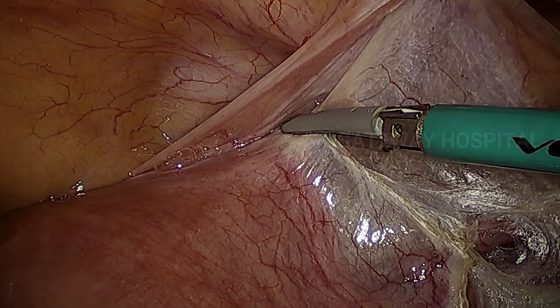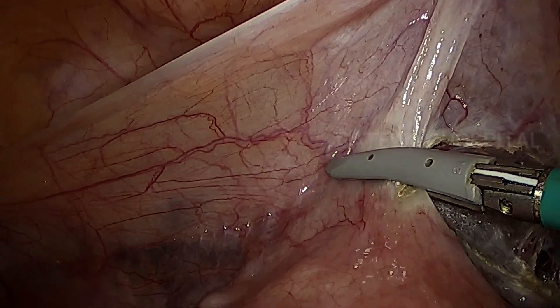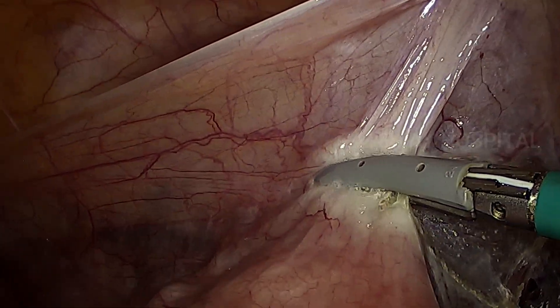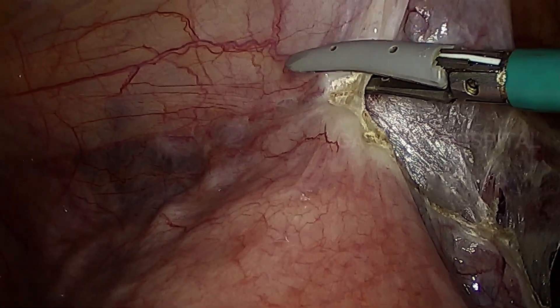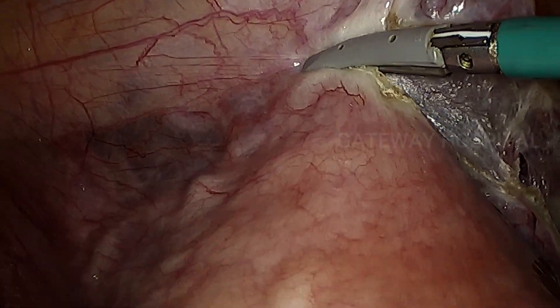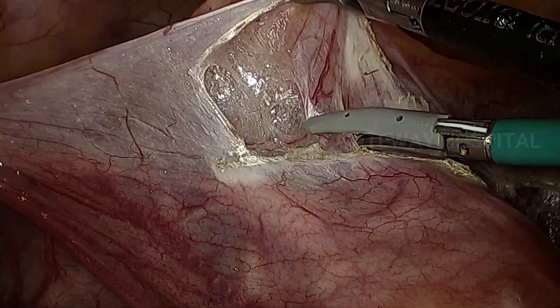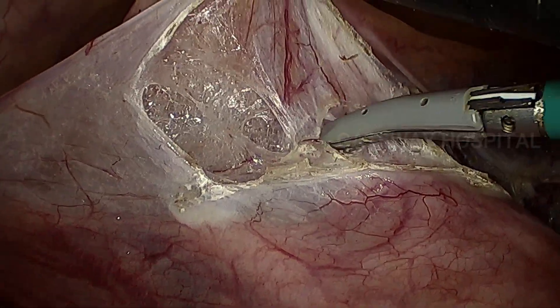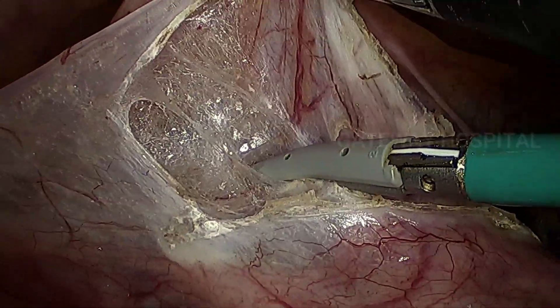In case of a previous cesarean section, you have to be very careful at this level because the bladder will be densely adherent to the cervix and lower segment of the uterus, and there is a possibility of bladder injury. We are extending the incision beyond the UV fold of peritoneum into the left side broad ligament.